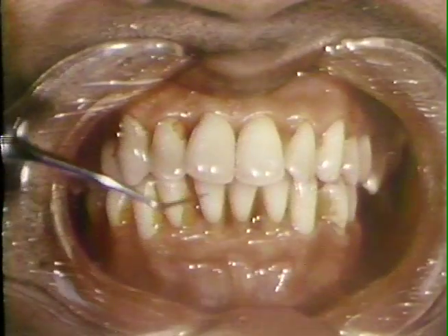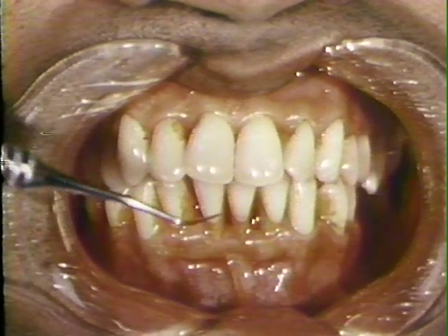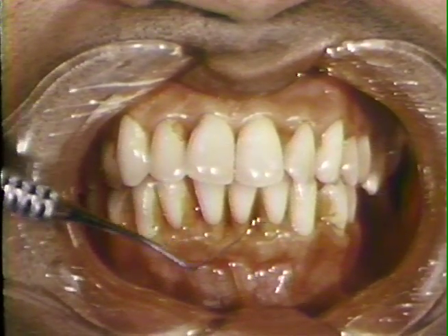Disclosing solution is again applied to check effectiveness of the patient's oral hygiene. There is retained plaque interproximally in areas of exposed root surfaces.